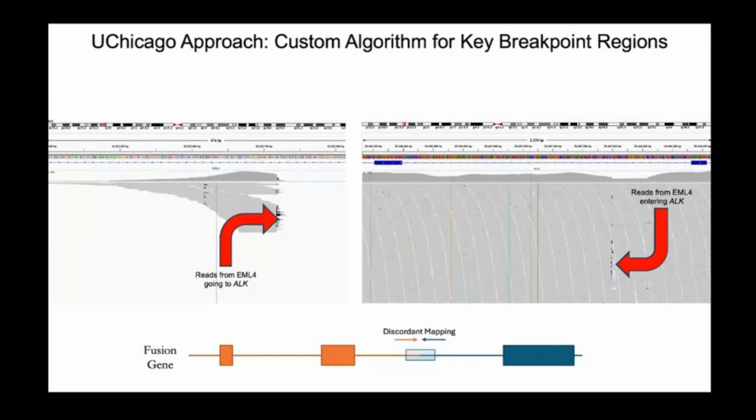A major criterion for reporting a structural variant in our lab anyway is that the pathologist needs to be able to believe the possible rearrangement is real by actually looking at the reads in IGV. For most samples, the repetitive noise is removed up front, so the number of things that we need to review is really minimal. It can be done quickly. And by implementing this kind of strategy, using our own coding to put something together that works better for just these focal things, we've actually never seen a missed fusion in our lab in one of the key genes that we specifically target this way. So this is an example where, if you have the ability, it sometimes makes sense to code something that isn't just designed for somebody else's research data, but is designed for your assay.